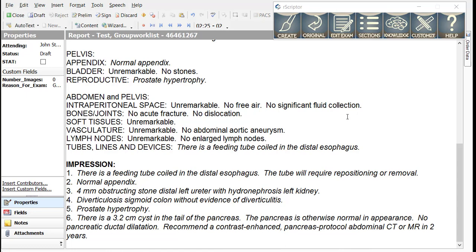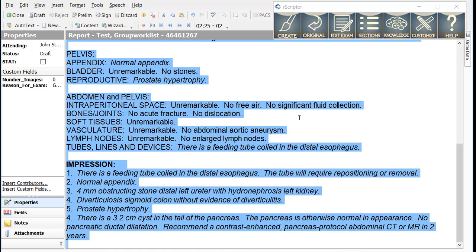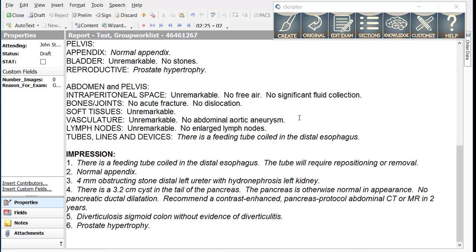If you wish to change the order of the impression, simply change a number in front of an impression item to a new number, push the Create Report button, and the impression will be reordered.